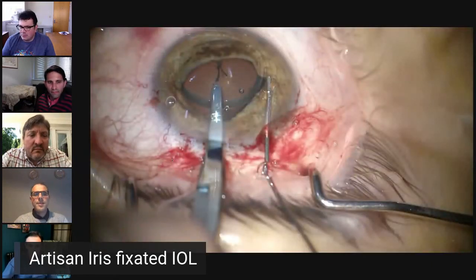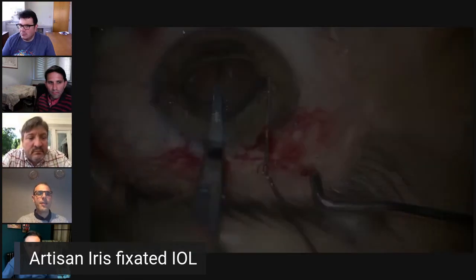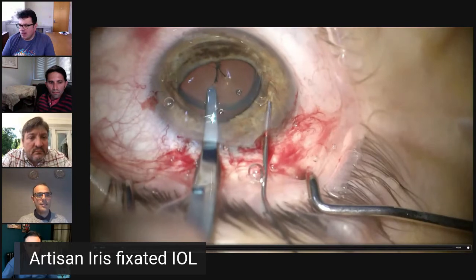Thank you. Yeah, I totally agree. Minimal manipulation is the best way to achieve a good outcome. When the technique of retropupillary Artisan was initially described, people tended to put the whole lens behind the iris, engage one side of the iris, then swap hands and engage the other. This tends to irritate the iris a little bit. But if you put one haptic at a time and keep the lens in front of the iris until you go back and engage the second haptic, that often causes less iris manipulation or trauma.